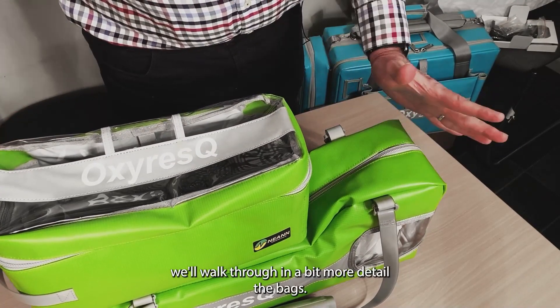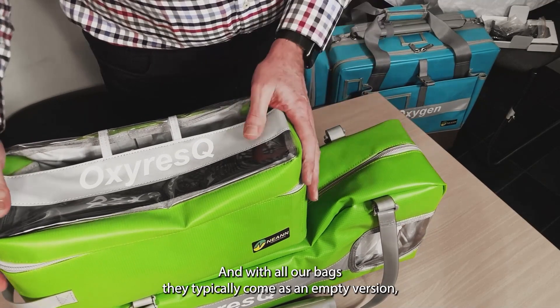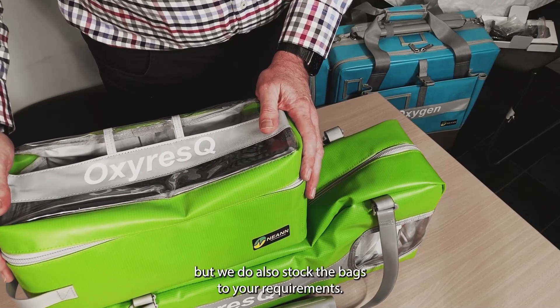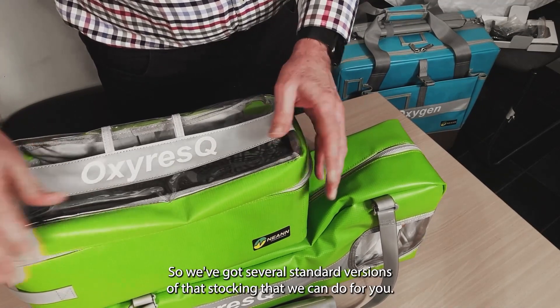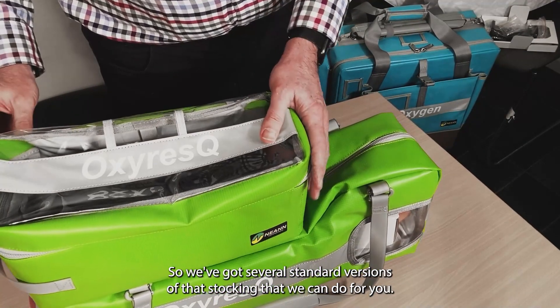Now we'll walk through the bags in a bit more detail. With all our bags, they typically come as an empty version, but we do also stock the bags to your requirements, and we've got several standard versions of that stocking that we can do for you.